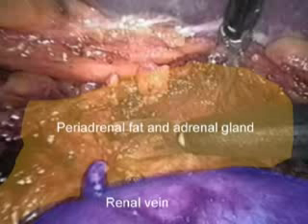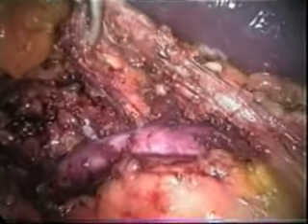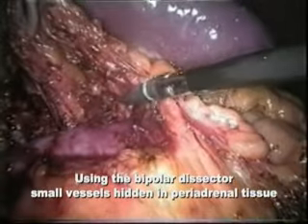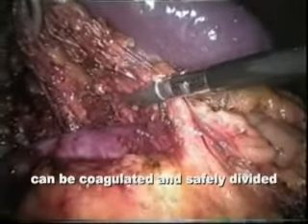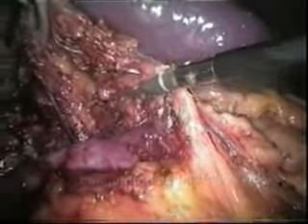We now begin the mobilization of the adrenal gland dorsally to the renal vein. This anatomic sketch outlines the main structures. We are now introducing the bipolar dissector instead of the monopolar scissors. Using this bipolar dissector, small vessels hidden in periadrenal tissue can be coagulated and safely divided.